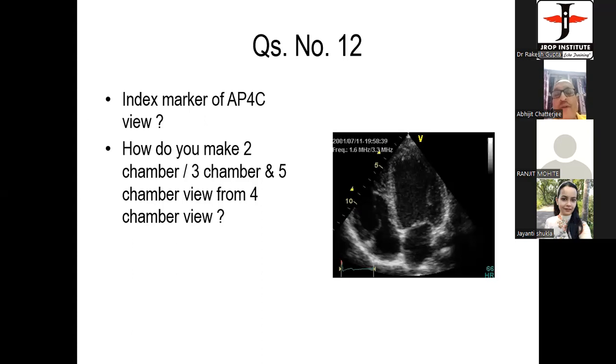Are you doing echocardiography in your place? No, sir. Presently, I'm not doing. You have not handled the machine, right? No, sir. If you're not able to handle the machine, what will you do subsequently? Sir, I am planning to purchase the machine, but because of PCPNDT, I am not getting it, because I am practicing in the periphery. So I require some training certificate. Yeah, I got it.